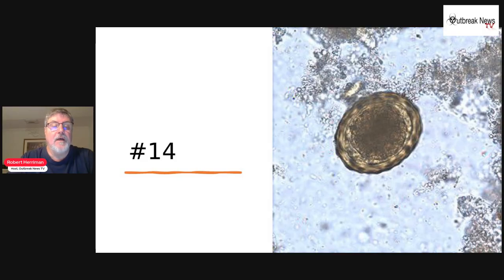Fertile stages range from 45 to 75 microns in length. And there's another stage called unfertilized, which are usually elongated and larger than the fertile ones, up to 90 microns in length. Their shell is thinner and their mammillated layer is more variable, either with large protuberances or practically none.